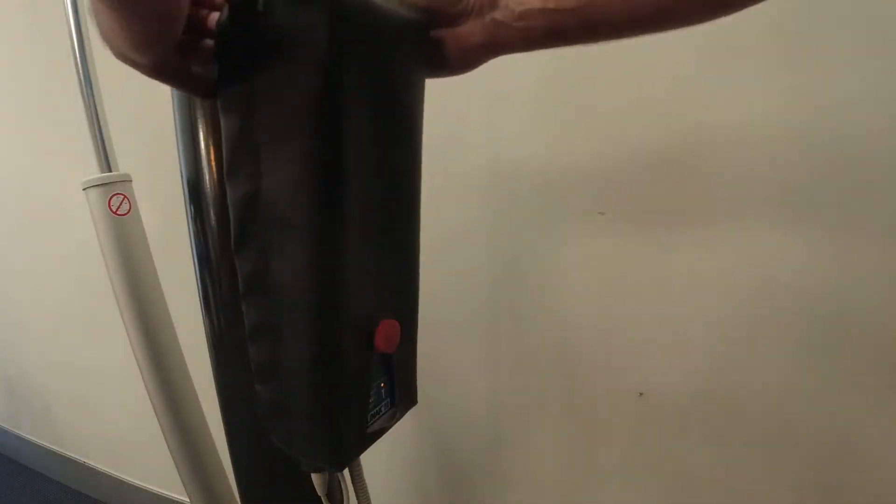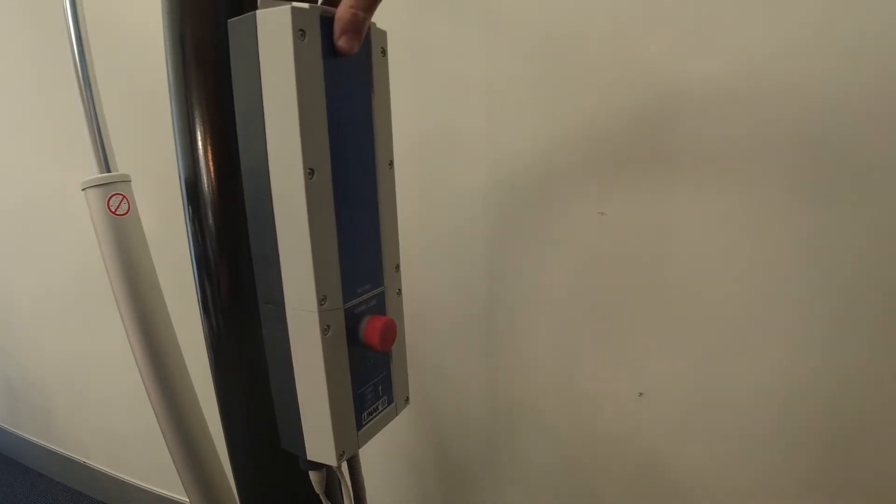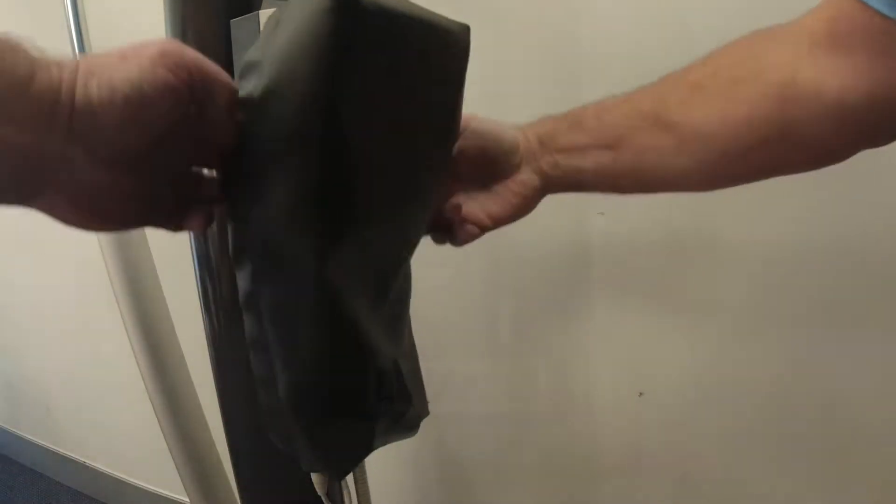The battery is easily quick released and you remove it to recharge. It is recommended that the battery cover should remain on the battery housing to avoid damage or weathering.